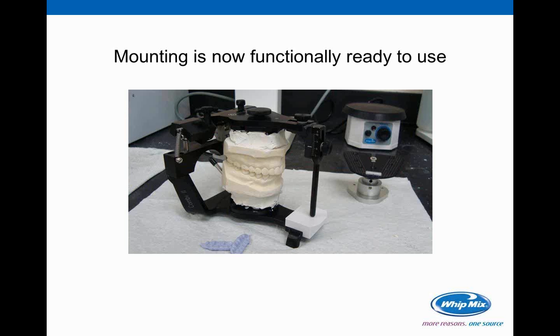It has been placed now in the articulator inside the Bonwill triangle. Your positions are correct relative to the condyles, and the envelope of function will now be as correct as it can be based on the fact that you didn't get a lot of information from the doctor.